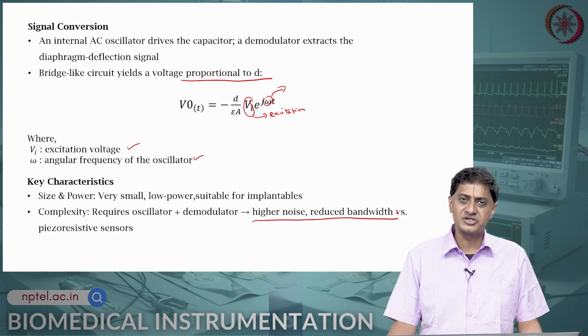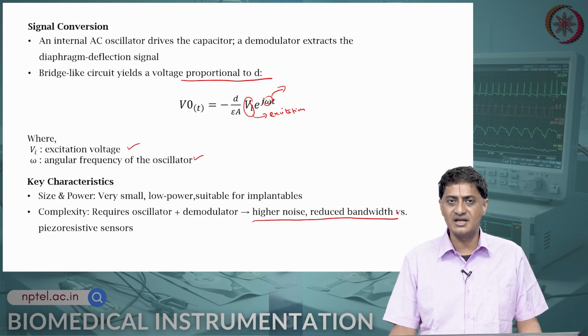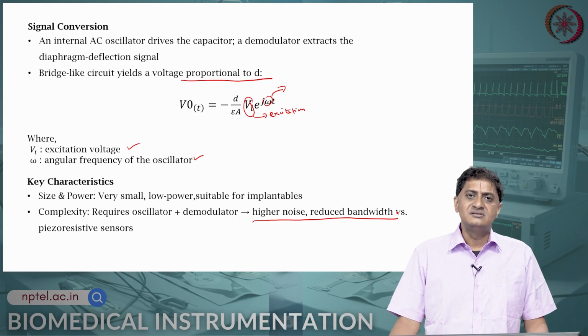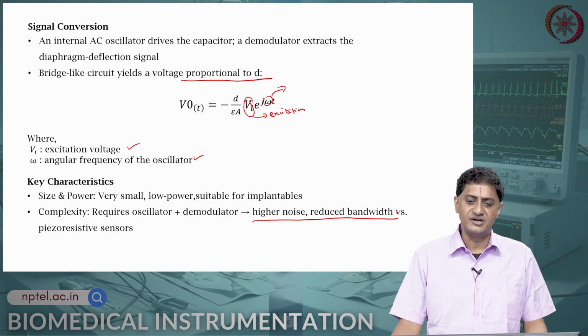If a pattern of pressure is detected that is considered anomalous or dangerous, then the system can alert the clinician saying that a patient in this bed is having this problem. Then the clinician can take an appropriate decision, for example. This is the current work and the future in this field.